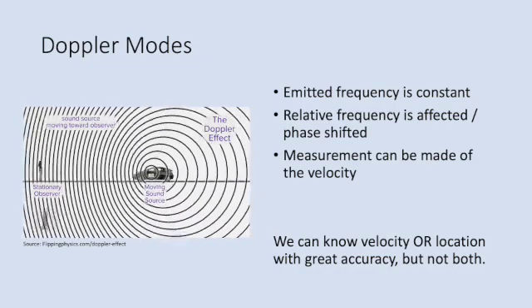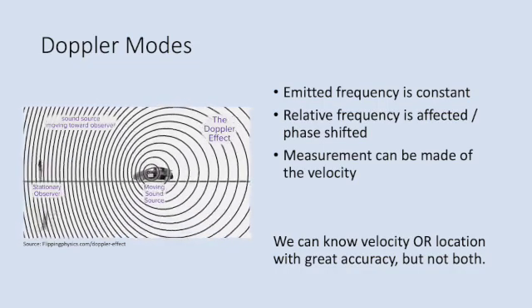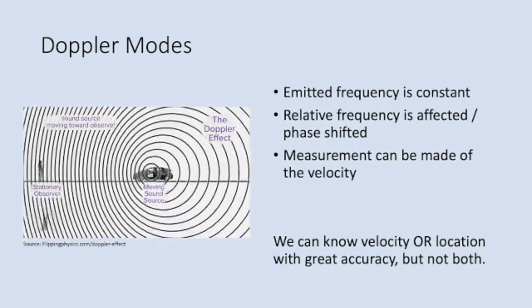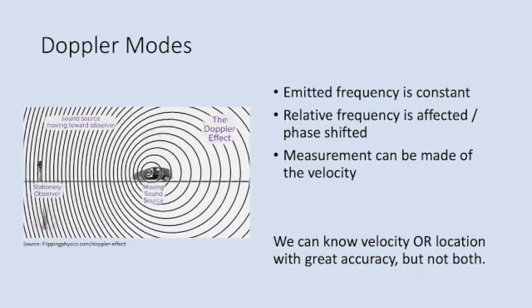While this is not something that we commonly encounter in point-of-care ultrasound, if you get into some of the more advanced applications, more advanced cardiac or fetal ultrasound, you may need to know that velocity and location both independently can be measured with accuracy, but sometimes trying to get more of one will impede your ability to measure the other.